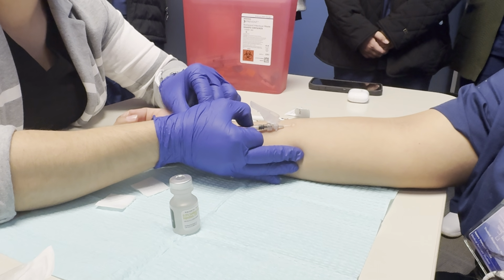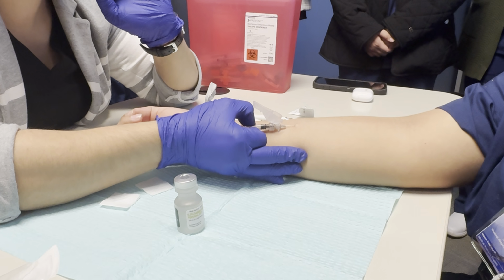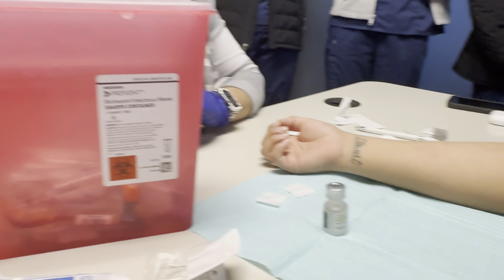Okay? And I'm all done now. I'm going to go ahead and let go of it. Somebody tell me, what's the first thing I do when I take my needle out? Safety. What's the second thing? Sharps. Safety, sharps. Straight to that.